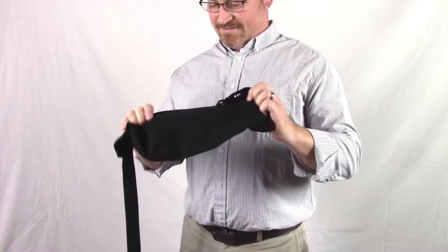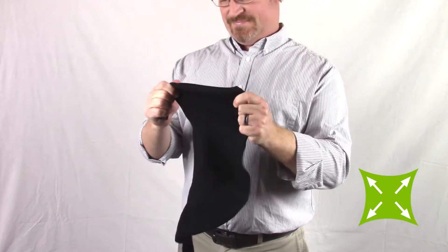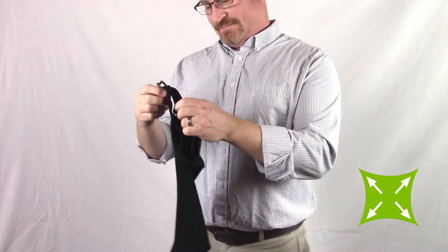This is the Jocelyn Ultimate Arm Sling. It's a cotton spandex arm sling that features a four-way stretch for a comfortable fit and maximum support.